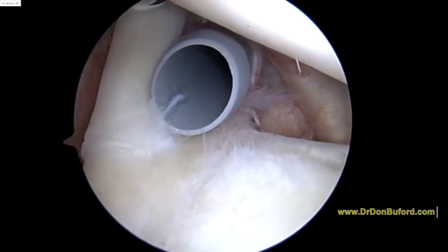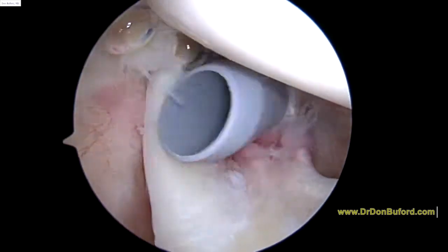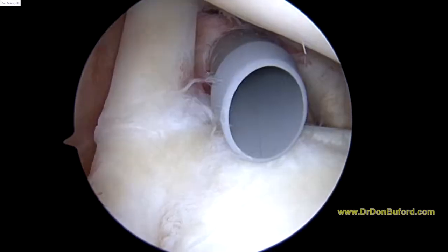Hey, it's Dr. Buefer. We're just getting started on the right shoulder. We're looking in from the back to the front. Everything you see is magnified 30 or 40 times on the screen. We're just getting our first look inside.